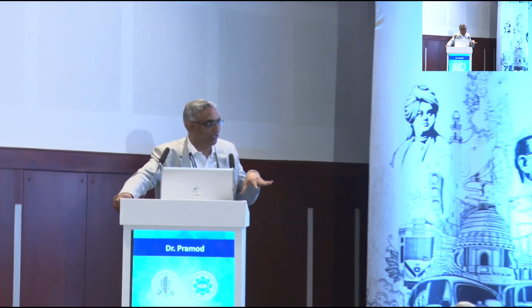Yeah, that's what I said. In most of the PVR, I still try encirclage, and if there are inferior breaks, I would still put a broad buckle before doing retinotomy. Yeah, I still do that. I think that's the basic message, that retinectomy is actually the last thing. Yeah, after everything else is done. But there's a tendency to do retinectomy in the beginning itself. Agree. That's the last step always.